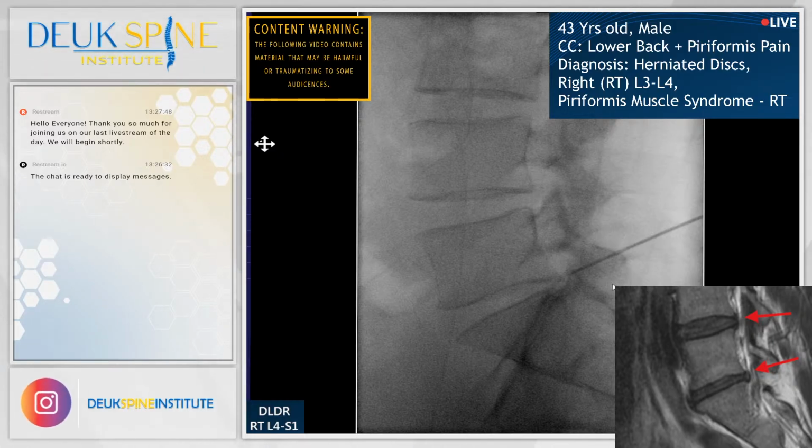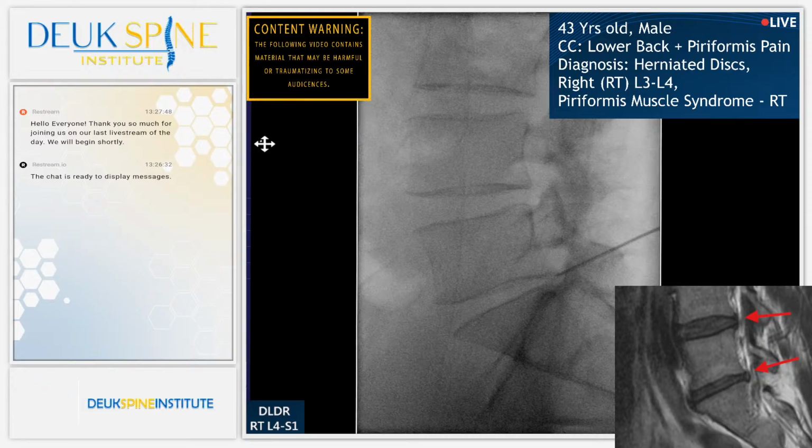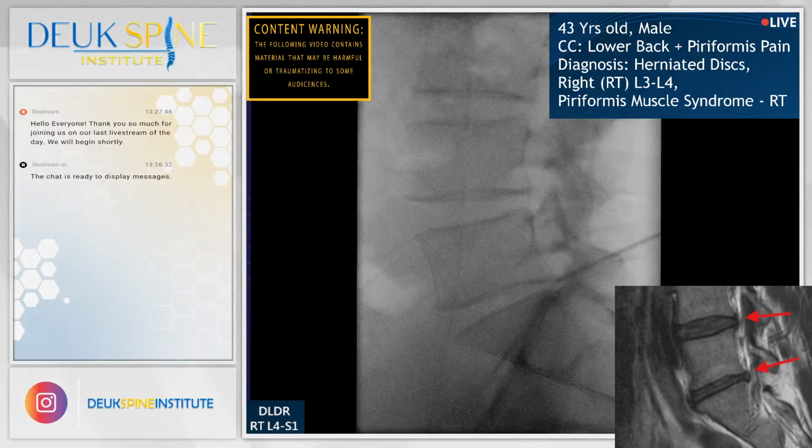Yes, that's because you're seeing it lighter because there's only one side that has that facet. The other side was drilled away by his original surgeon that did the microdiscectomy. We don't recommend microdiscectomy because it's a destructive procedure. It's an old procedure, been around a long time. I don't recommend it ever anymore to patients. It's too destructive, and it doesn't fix back pain. The Duke laser disc repair, on the other hand, does fix back pain.